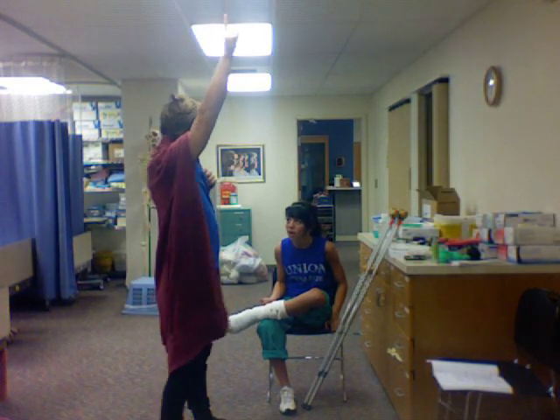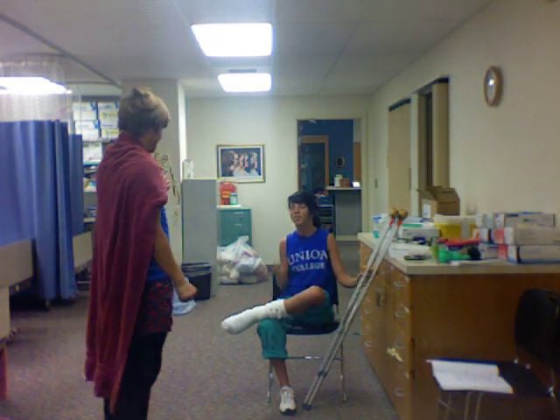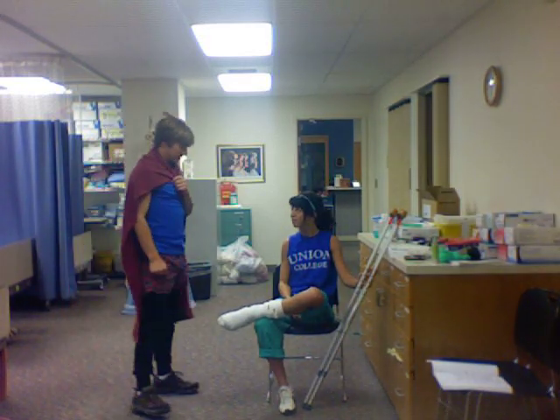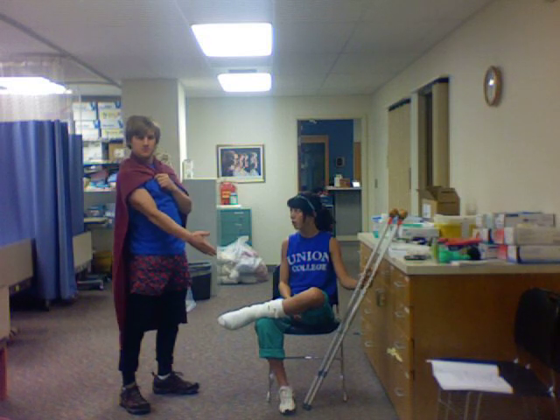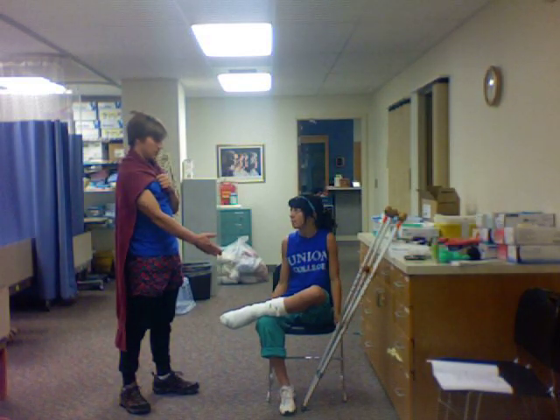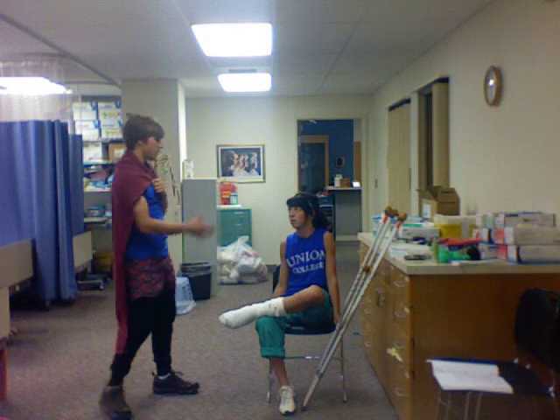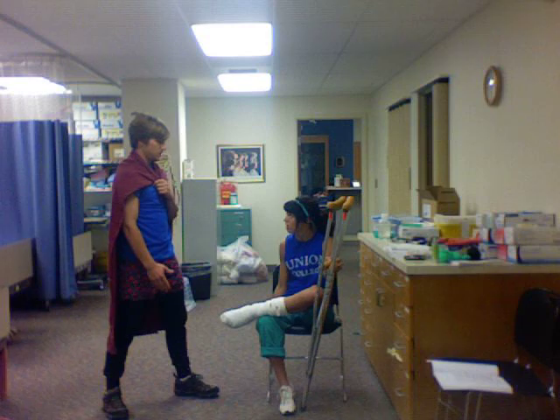Crutch Man, is that you? It is I, Crutch Man, coming here to rescue you. Thank goodness. So, maiden in distress, what happened to your ankle? Well, I was bouncing around doing a quadruple bypass flip on the trampoline, and then I just fell off onto my leg. That is a shame, and here you are in the hospital — stranded. Stranded in the hospital, and you need to go home. But alas, you do not know how to use the crutches. I do not know how to use my crutches.